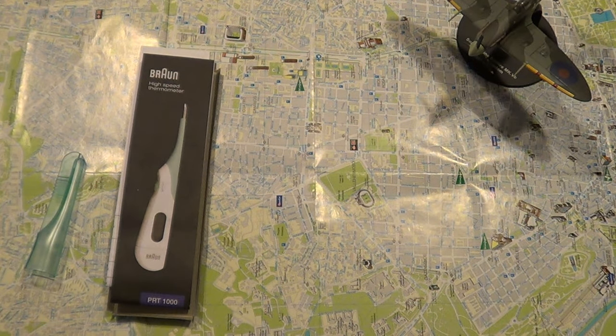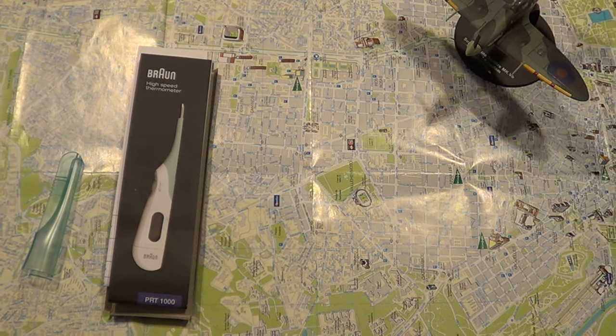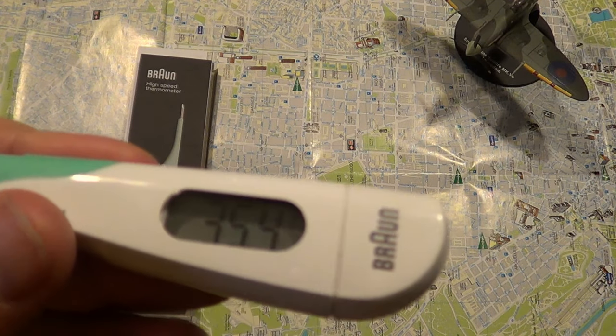It says it will take your body temperature in 10 seconds. I've put it in my armpit — you can put it in your mouth or whatever place you want to take your body temperature. We're waiting here for 10 seconds for it to make a distinct noise. It's been 10 seconds and it's already ringing.